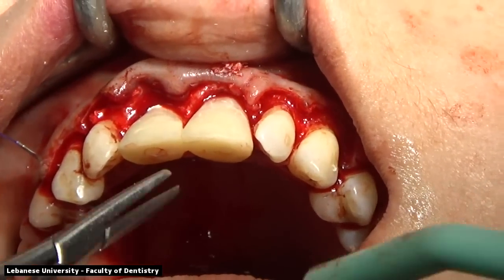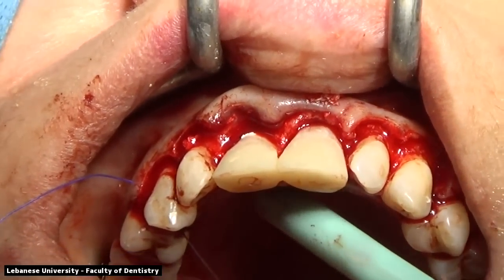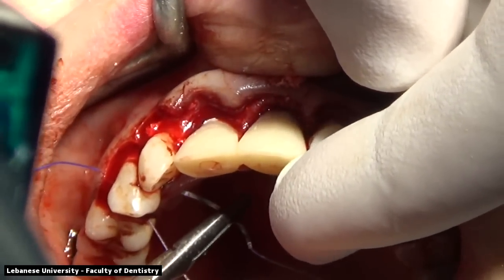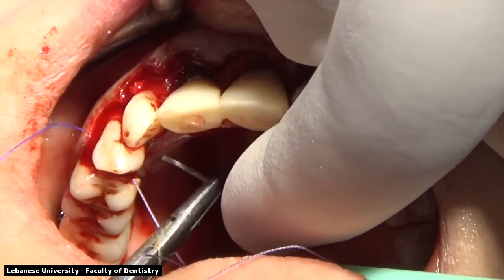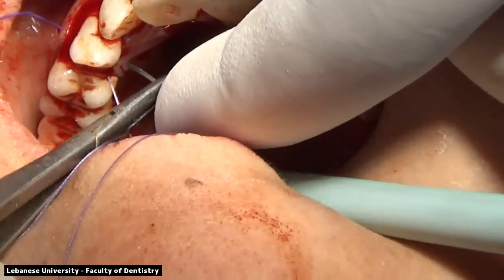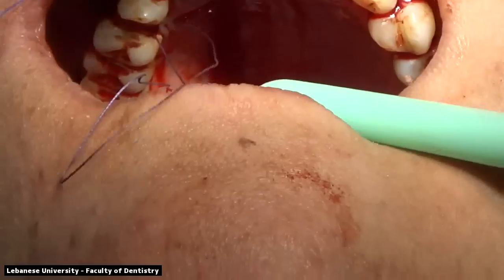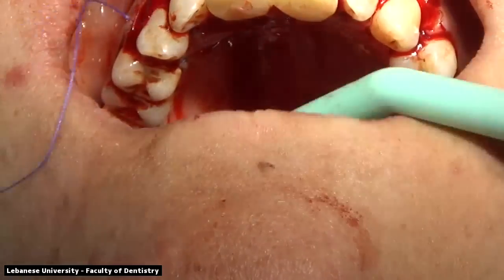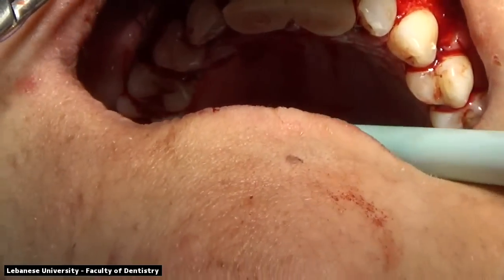The suture will be about 3 to 4 millimeters away from the papillary margin in the papilla area, going all the way to the palatal, engaging the palatal aspect and going back to the buccal area to close it. Try our best to be away from the margin of the flap so that we can engage more soft tissue, which will prevent the breaking of the suture later on. This will give us more support and more closure without tension of the flap.